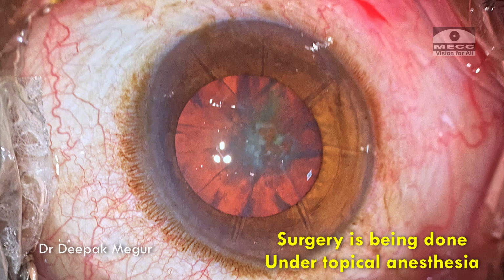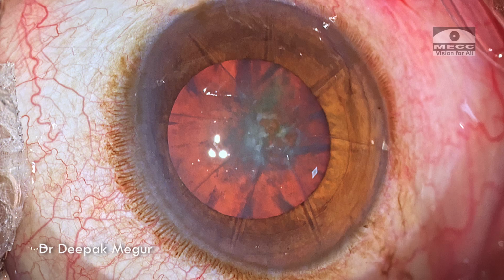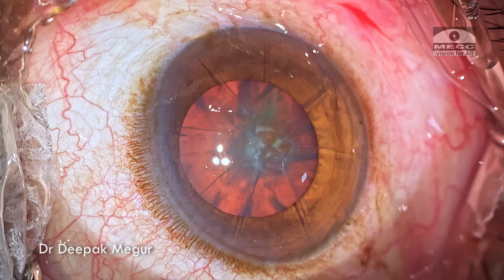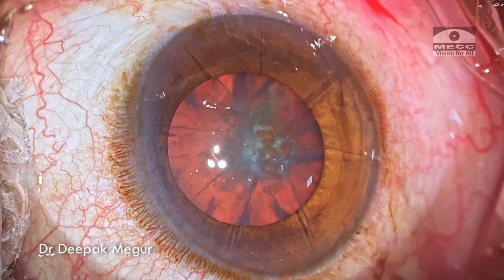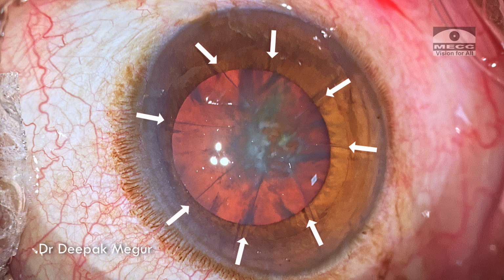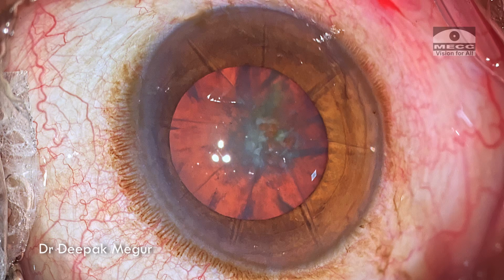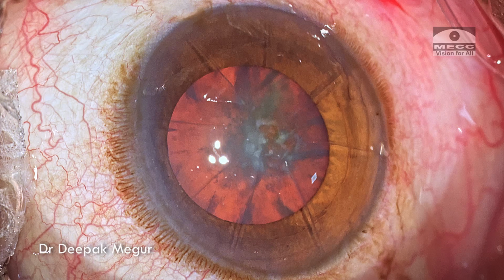Now, moving on to surgery. Surgery is being performed under topical anesthesia. The patient is quite comfortable and relaxed. And the major concern or the intraoperative challenge is I need to ensure that these cuts don't give way. There have been multiple reports that these cuts can give way during the surgery. So I am planning in such a way that I don't have that intraoperative complication.